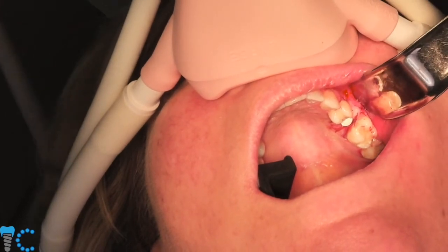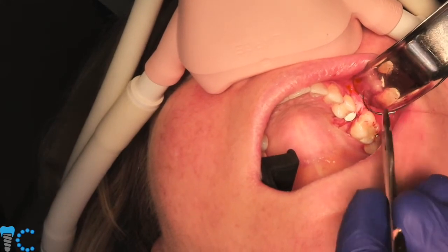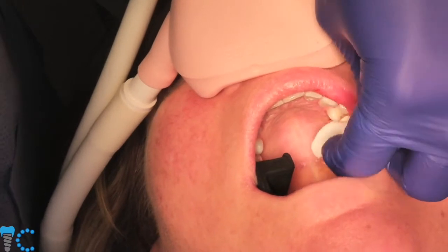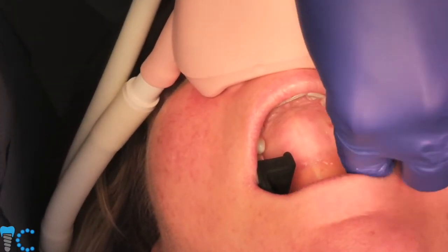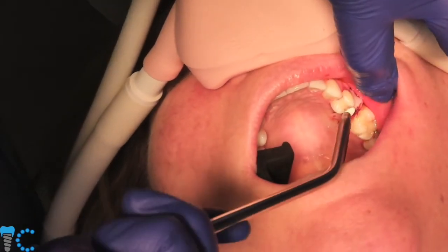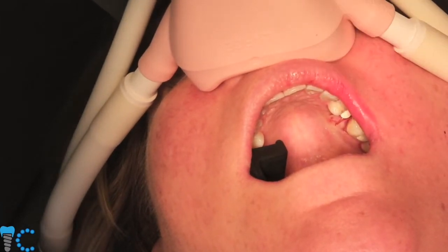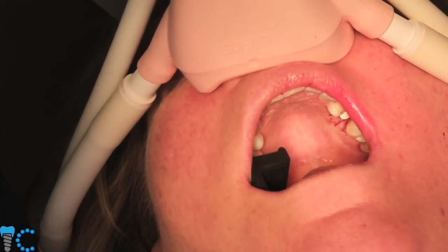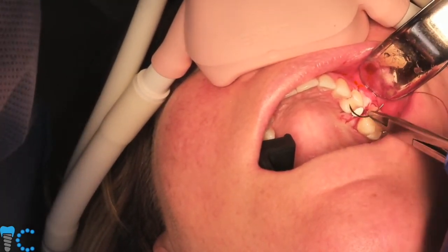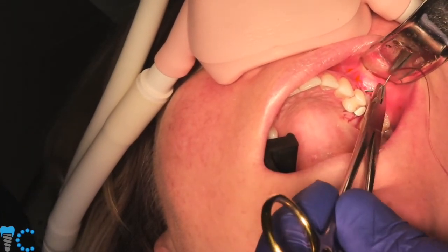And can you prep this implant or the abutment? Yes, you can prep the implant and the abutment, and that's one of the beauties of the system. So when you think tissue level implant, I don't want a tissue level implant. Let me tell you, you should want a tissue level implant because they're much easier to use. And what makes people not like tissue level implants is because in the past it was a metal implant, and the top of that metal implant was right at the top of the tissue. So if you lost any tissue height, you had an aesthetic nightmare.